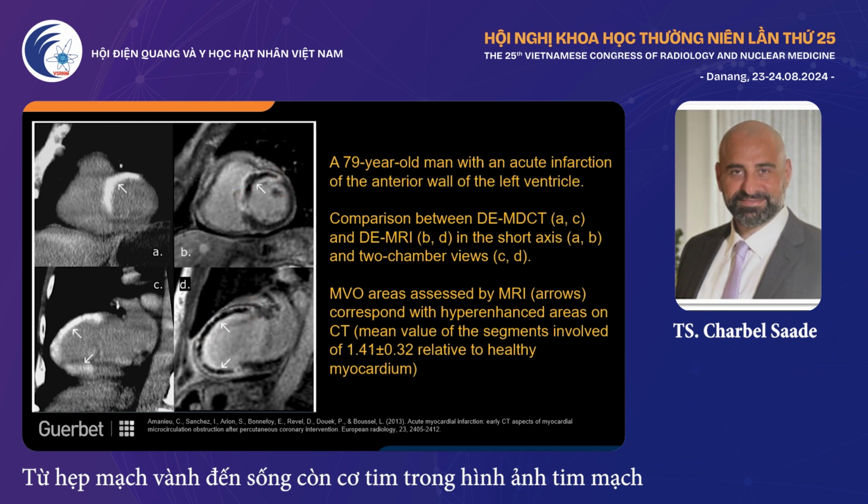So here we can actually see that CT is still not viable for cardiac microvascular obstruction relative to cardiac MRI. I still think cardiac MRI is the gold standard.